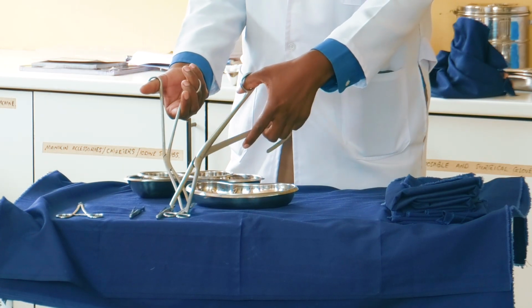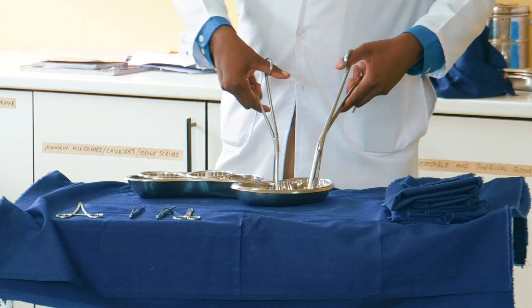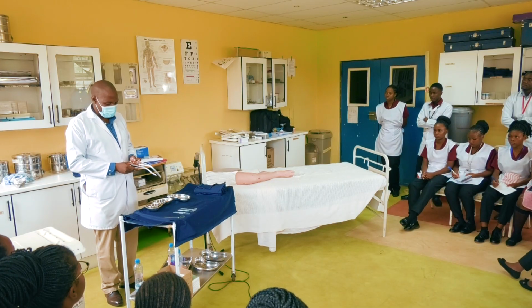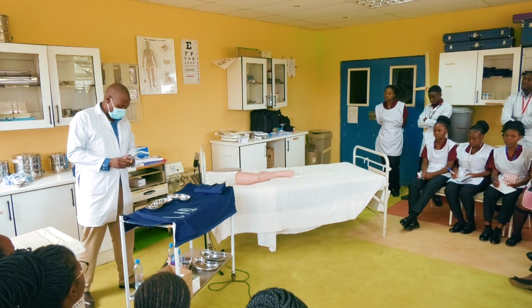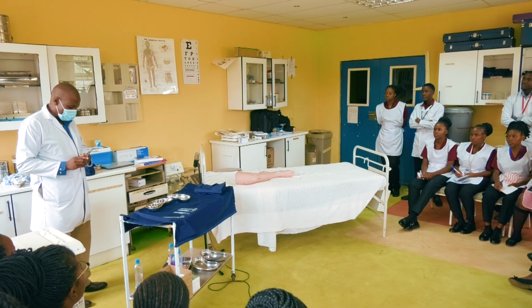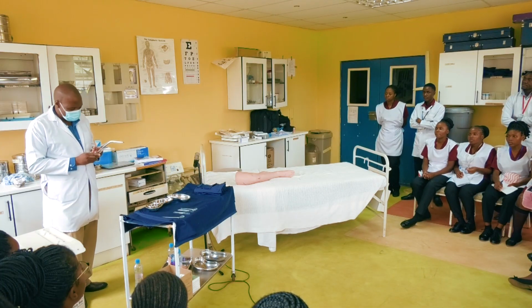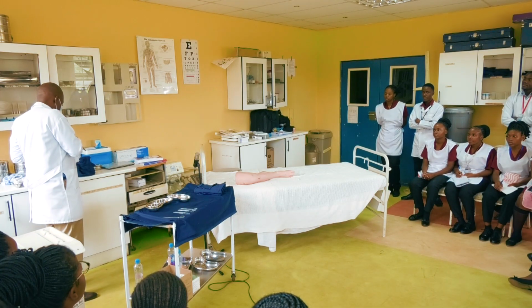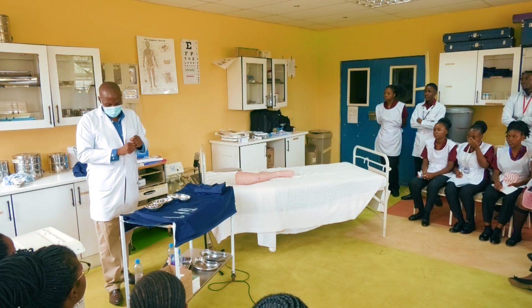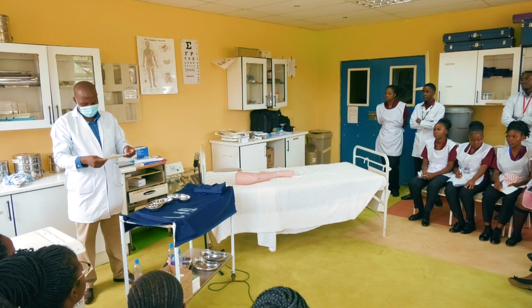So like we said, it's better you do most of the things yourself, unlike using the assistant. I'll put my assistant here. My assistant will work at a certain time. So what can I do without troubling the assistant? What do I need right now? I'll ask my assistant to help me with the gloves, but since the assistant is also learning, because we need to have surgical gloves, I'll just help with these instructions again.